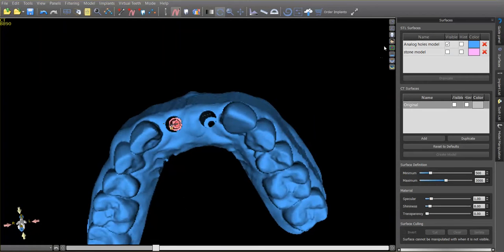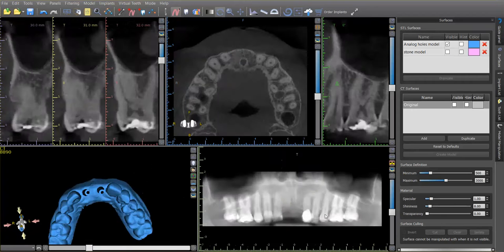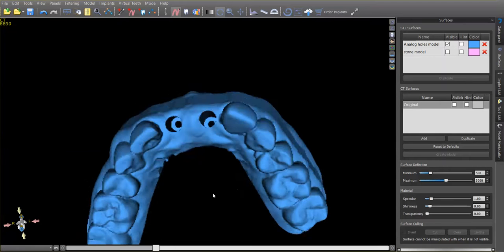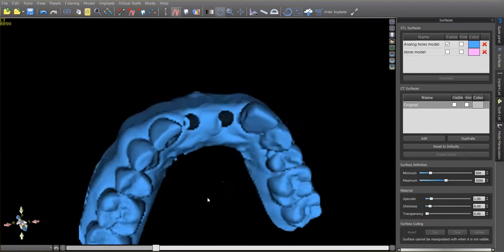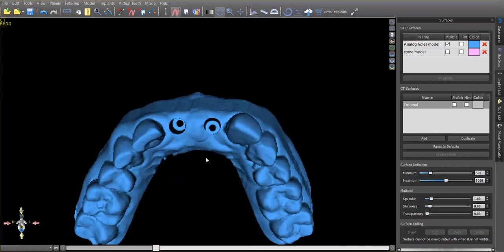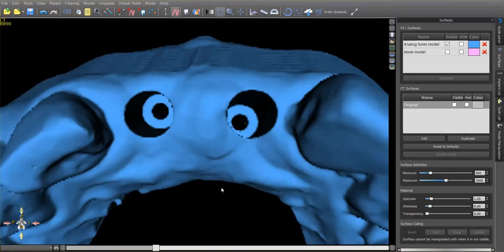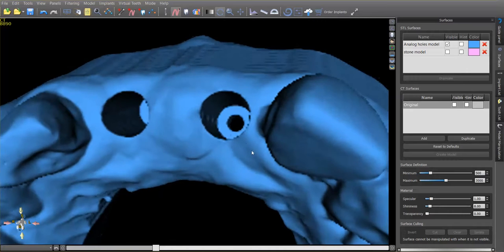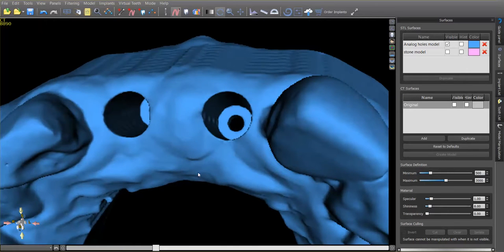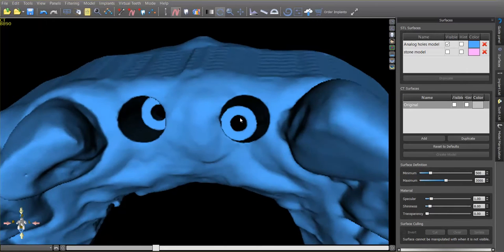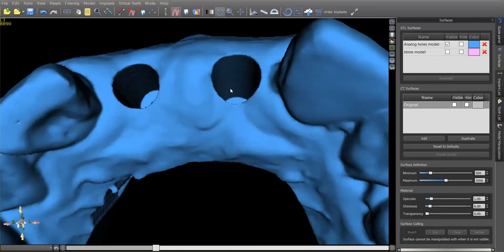This is an STL model that you could have 3D printed. And what it has is these holes created — now those are in the exact same position as your implants. They're created such that you could actually take the analog for, in this case, a Biomax implant, a three and a half diameter, and you could drop that straight into this hole. And it would bottom out, making it be at the proper position for the platform, the same as what we're planning to do with the guided surgery.